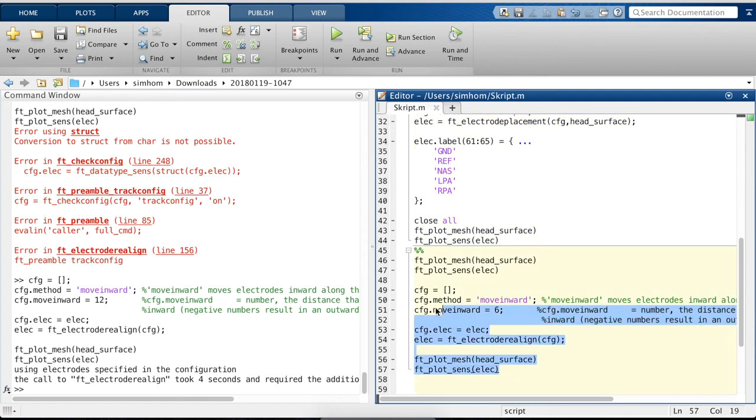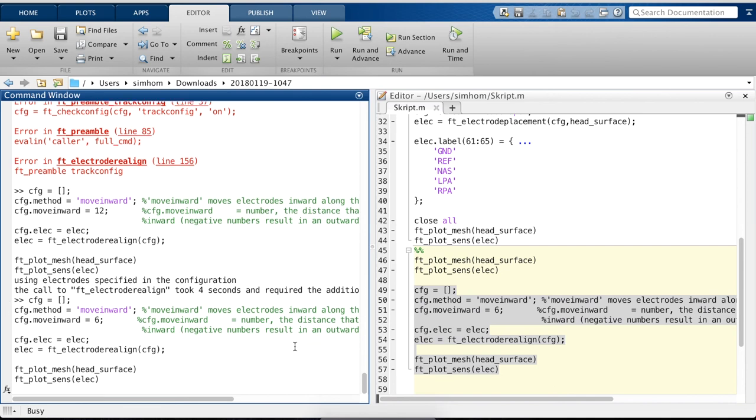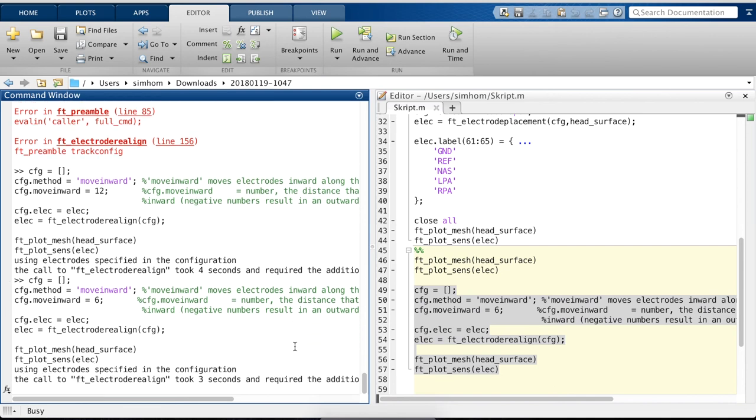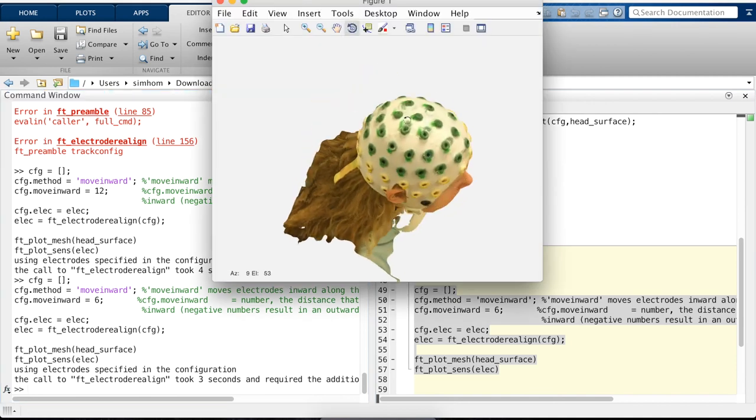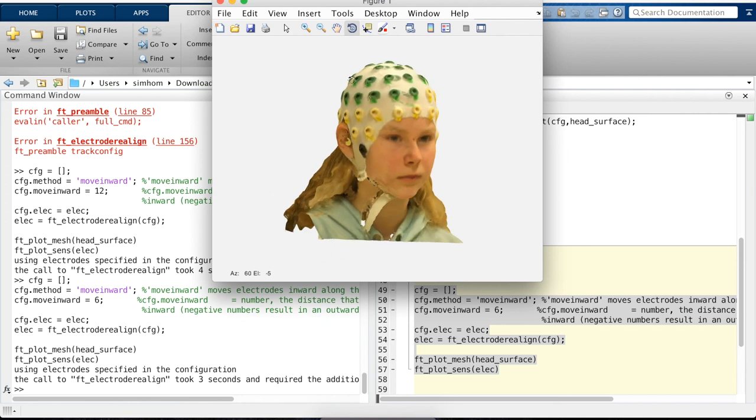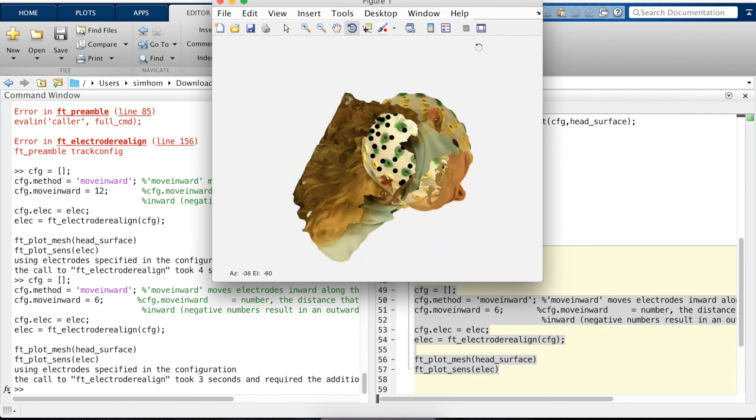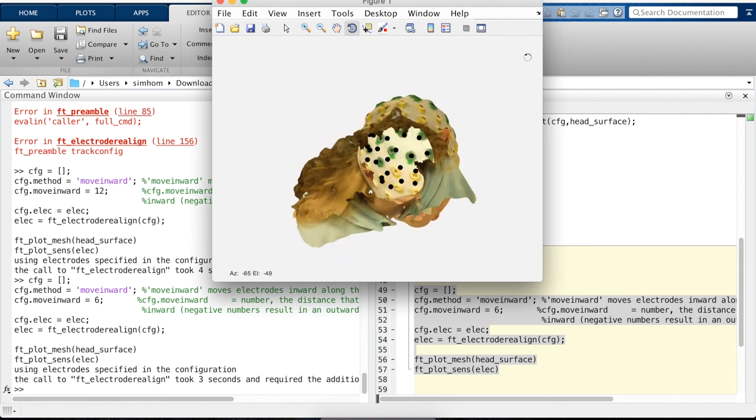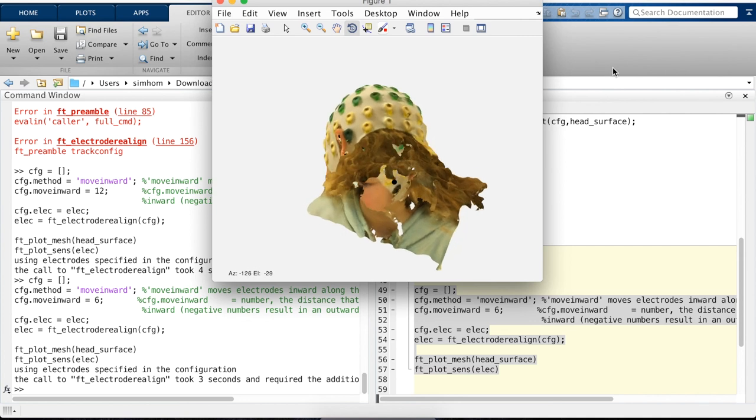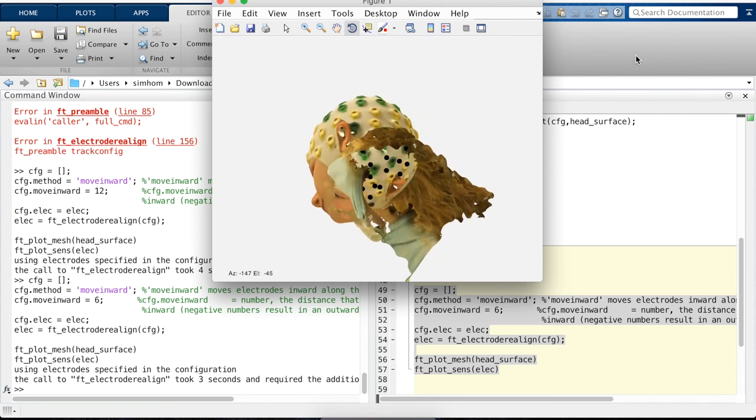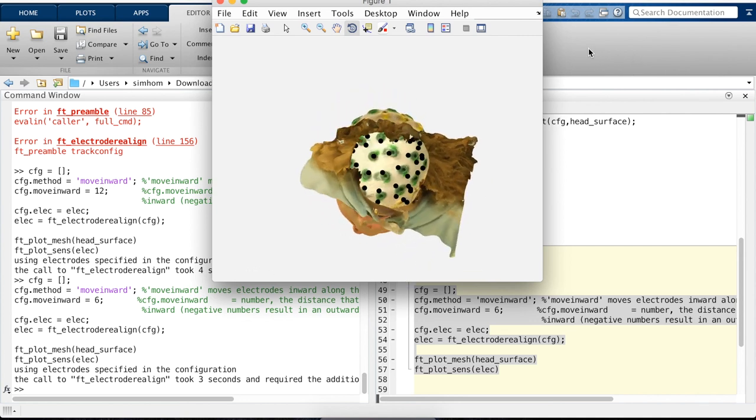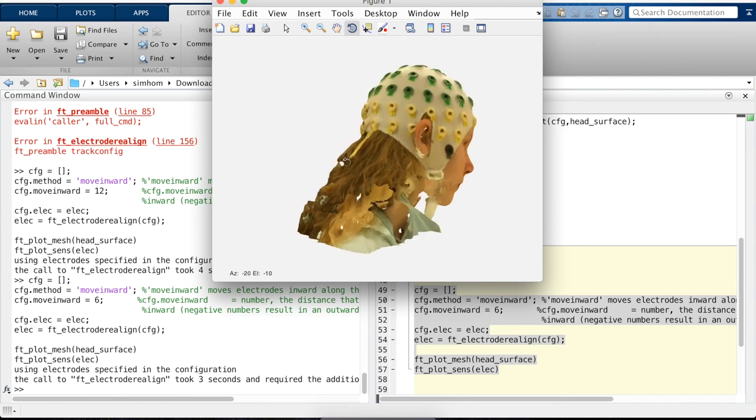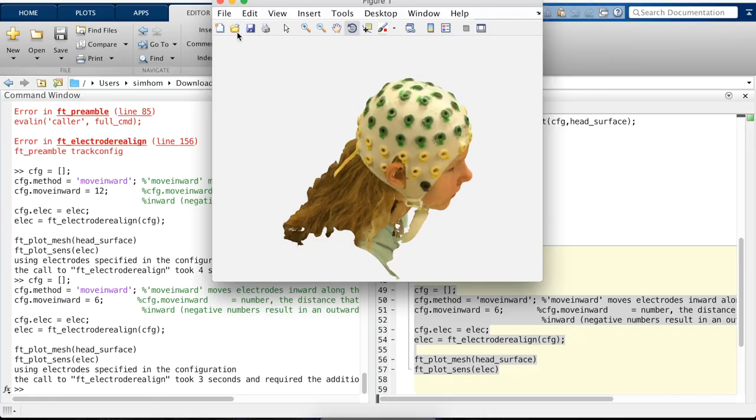One thing you might realize is that we clicked onto the cap, but actually an electrode would not be onto the electrode cap, but actually touching the surface. So what we do now is we move the electrodes inward inside the head. Now we can see them, but when I rotate it, you can see that every electrode has moved six millimeters inward. That's roughly the thickness of the electrode where we would clip it in. So that would be it. Thank you.